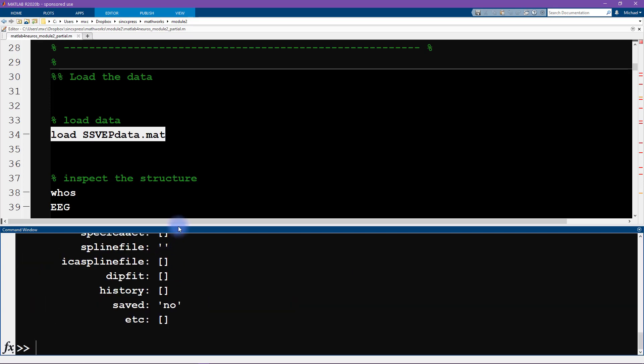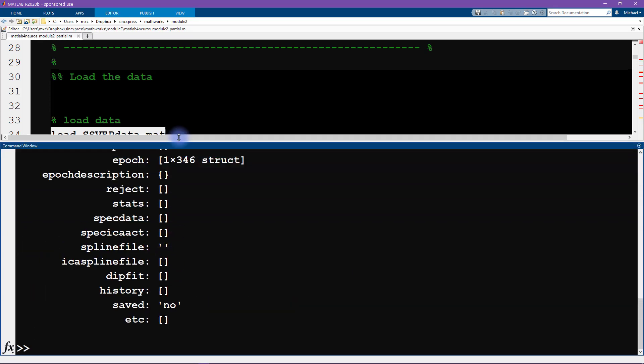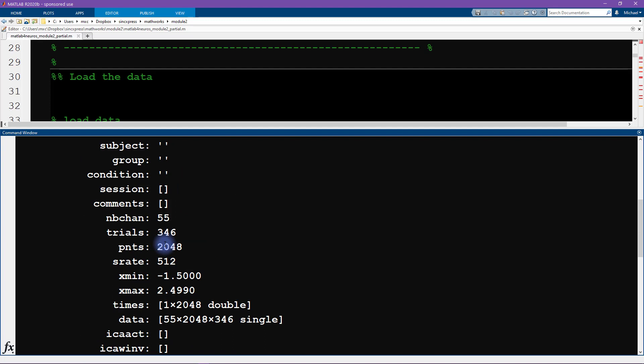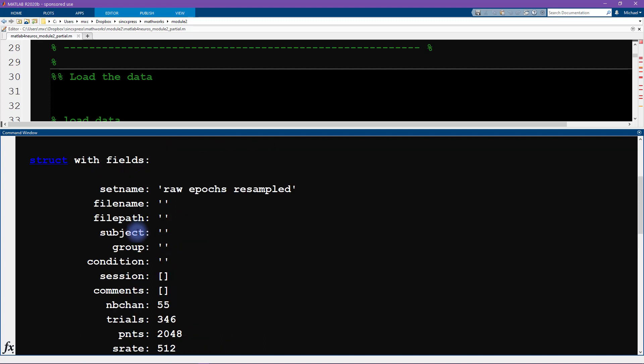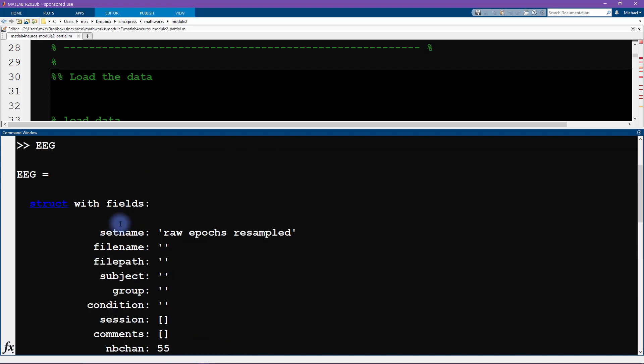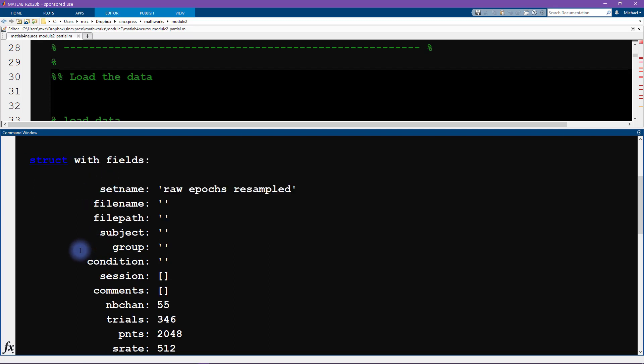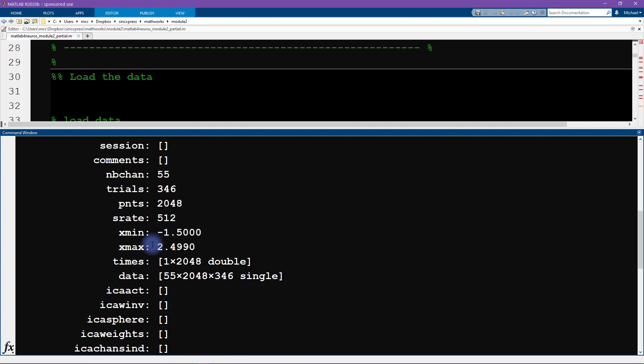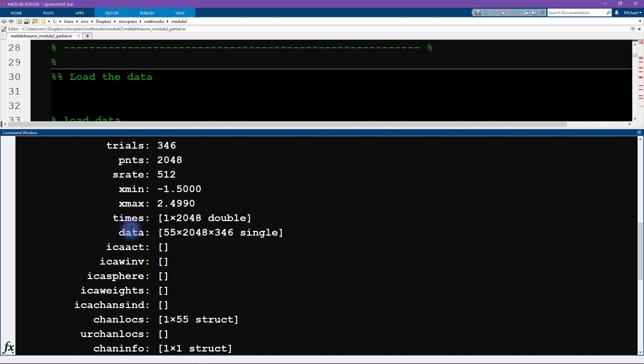Now this structure contains quite a bit more information. This is the data format associated with a toolbox called EEGLAB which is a popular toolbox for analyzing electrophysiology data. Now there's a lot of information here that we don't need to worry about. I'm just going to direct your attention to a few fields inside this structure that we are going to use.